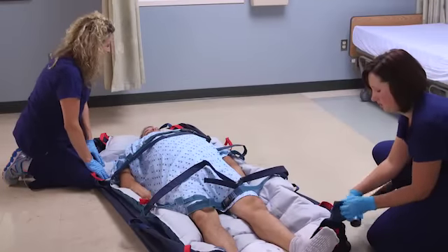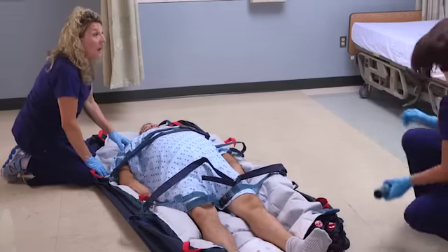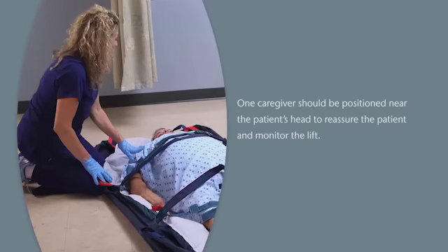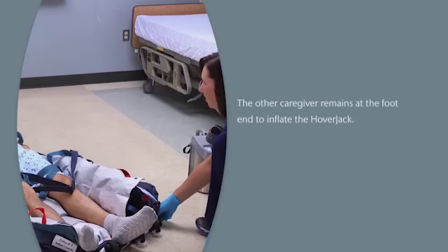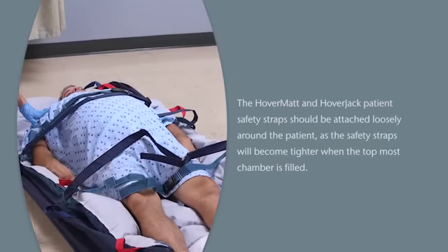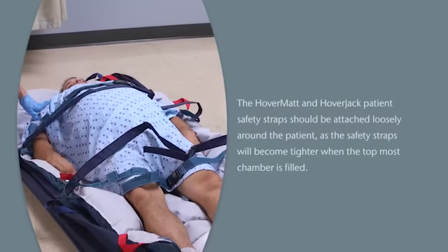Once the patient is positioned on the deflated HoverJack using either of the described methods, begin the inflation process. One caregiver should be positioned near the patient's head to reassure the patient and monitor the lift, while the other caregiver remains at the foot end to inflate the HoverJack. The HoverMat and HoverJack patient safety straps should be attached loosely around the patient, as the safety straps will become tighter when the topmost chamber is filled.